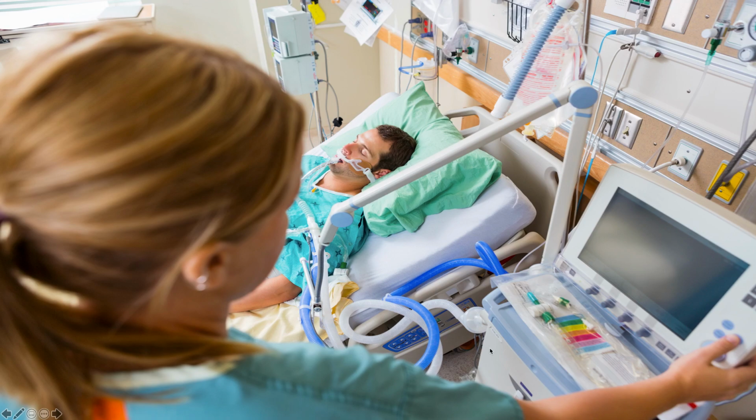And most pre-hospital and transport units as well, probably. It's a nice mode because, again, it kind of meets the minute ventilation requirements of the patient. It keeps the patient a little more comfortable because anytime they trigger the vent, they're able to take a breath, as opposed to the control, where if the patient tries to trigger a breath and the machine isn't ready to give one, they're not going to be able to trigger a breath.